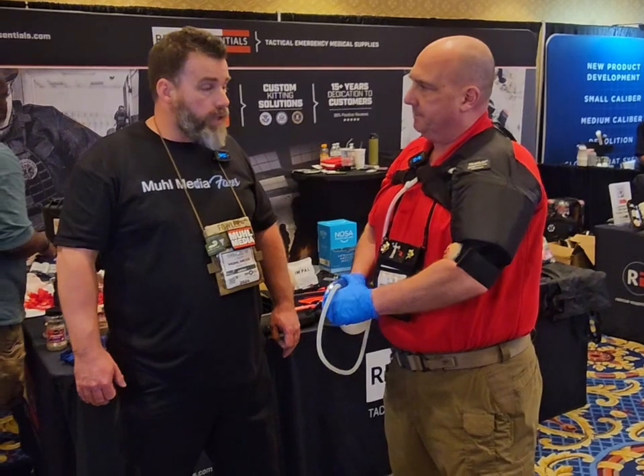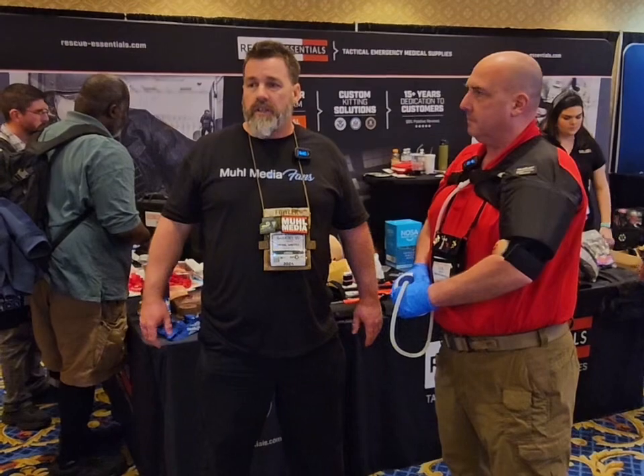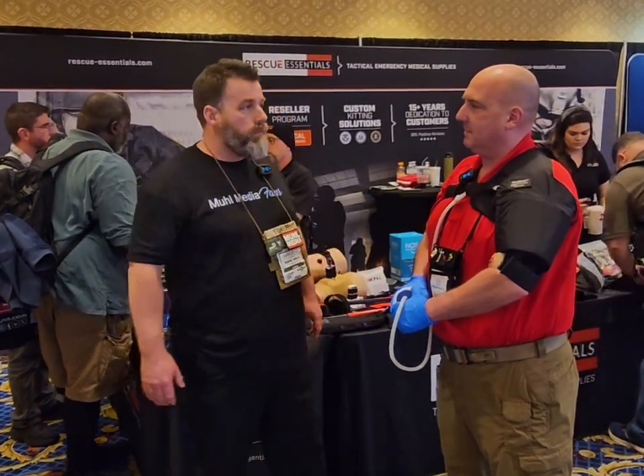Sounds like a great trainer. For anyone who does Stop the Bleed training, the TAP is something to consider. Thanks, brother.